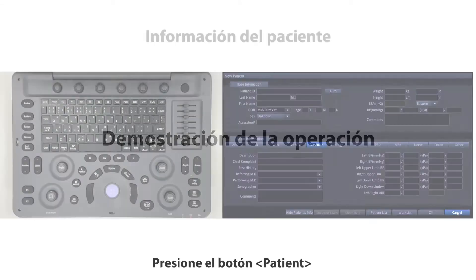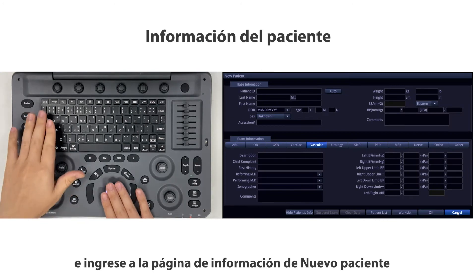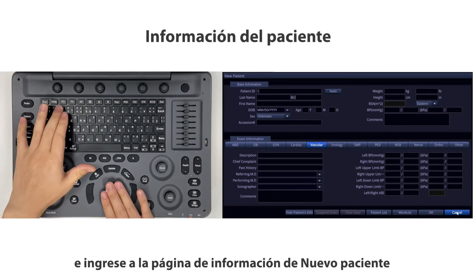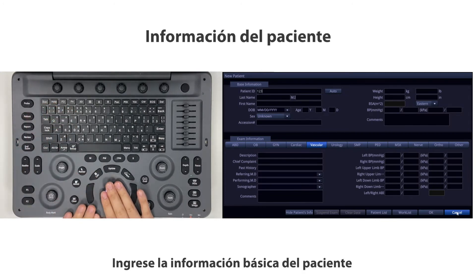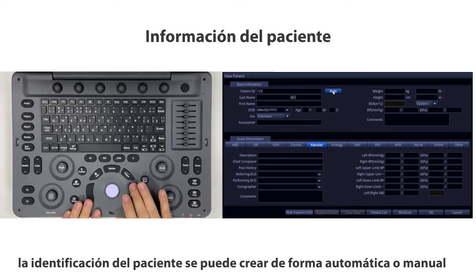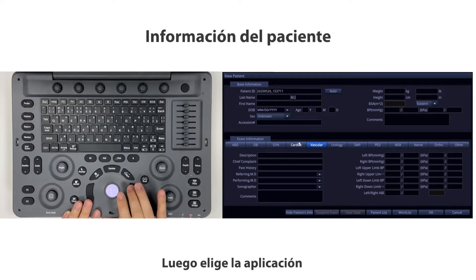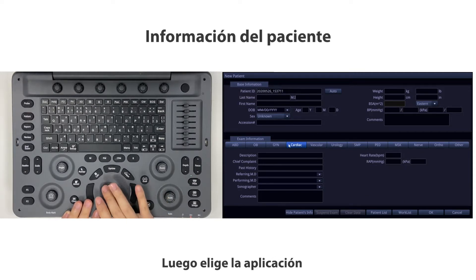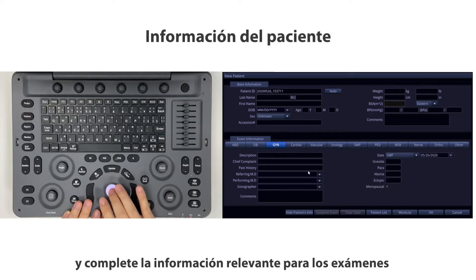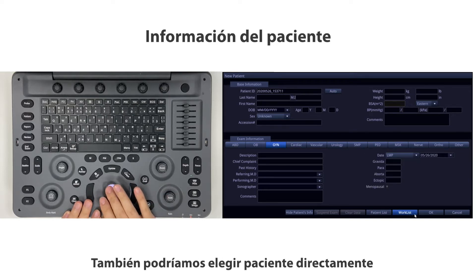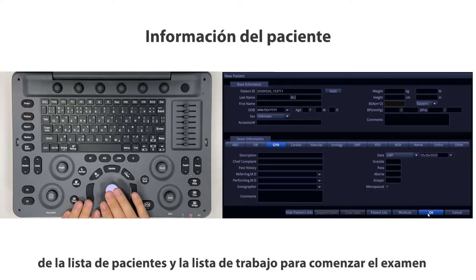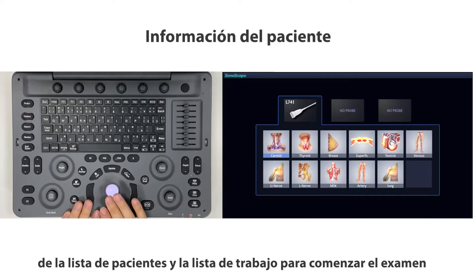Press the patient button and enter a new patient information page to input basic patient information. The patient ID could be created automatically or manually. Then choose the application and fill in relevant information for exams. You can also choose a patient directly from the patient list or worklist to start the exam.